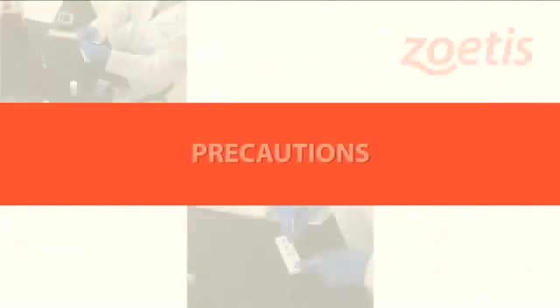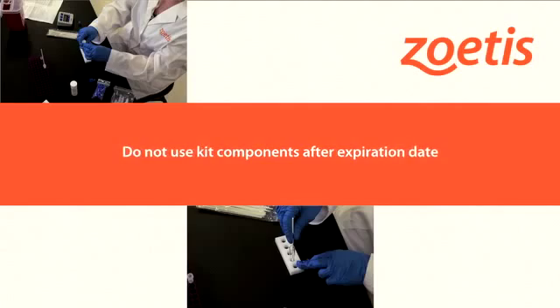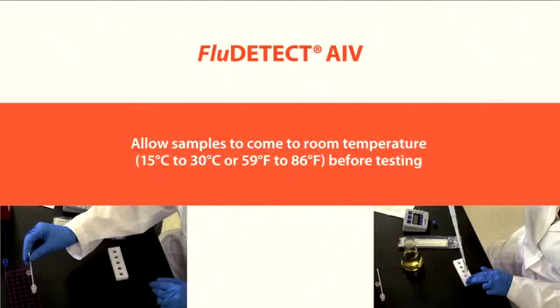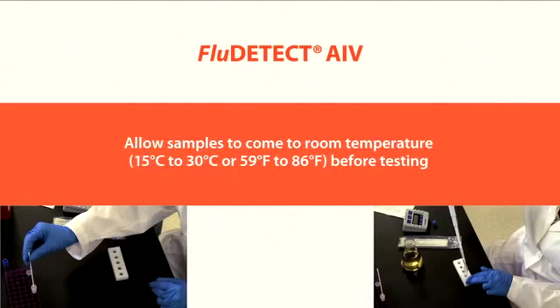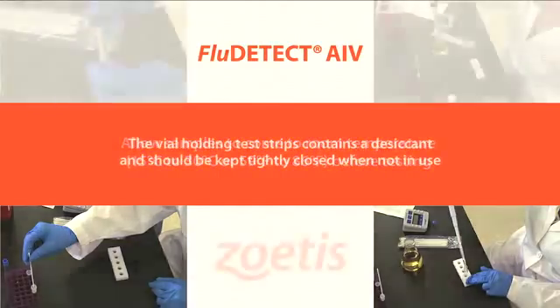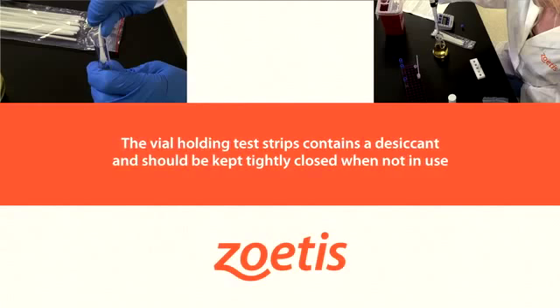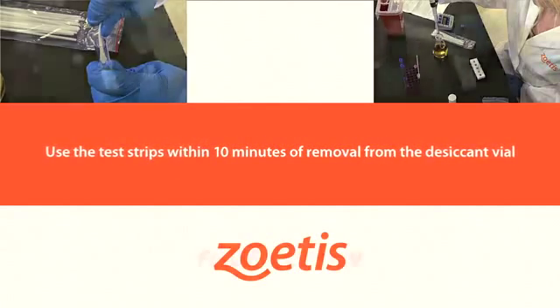There are a few precautions to be aware of before using FluDETECT AIV. Do not use the kit components past their expiration date. Allow samples to come to room temperature, 15 to 30 degrees Celsius or 59 to 86 degrees Fahrenheit, prior to use. The vial holding the test strips contains a desiccant and should be kept tightly closed when not in use. Use the test strips within 10 minutes of removal from the desiccant vial.